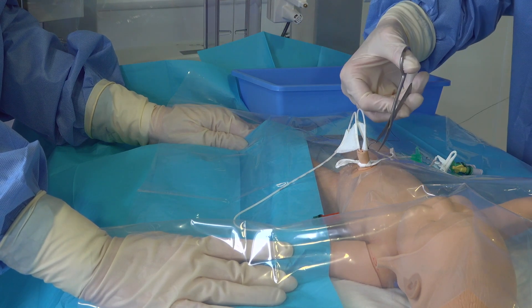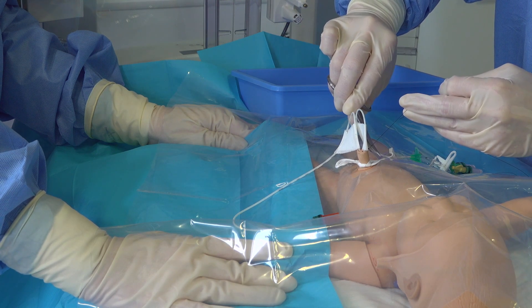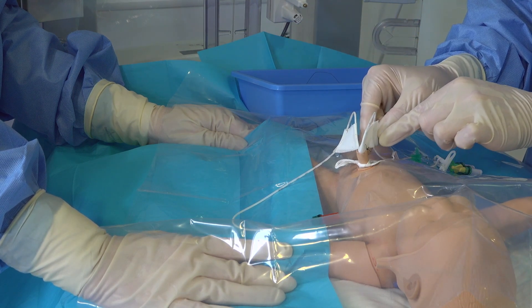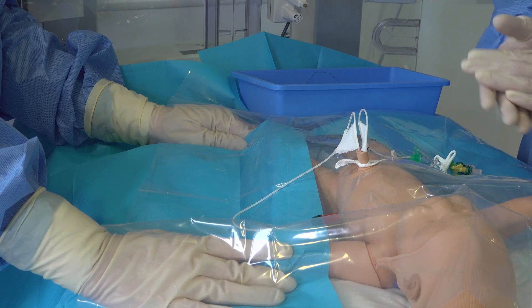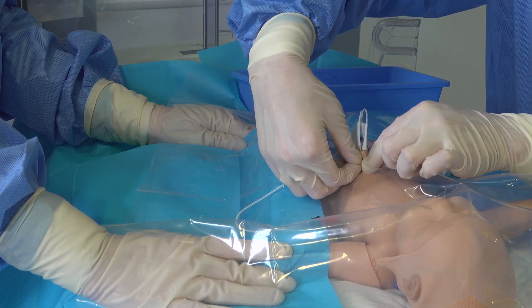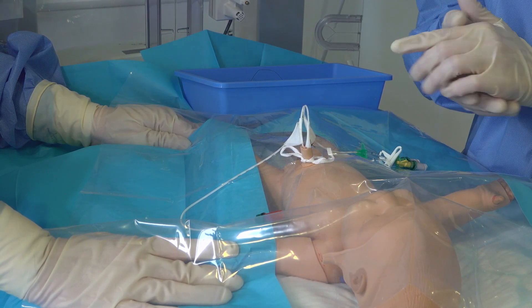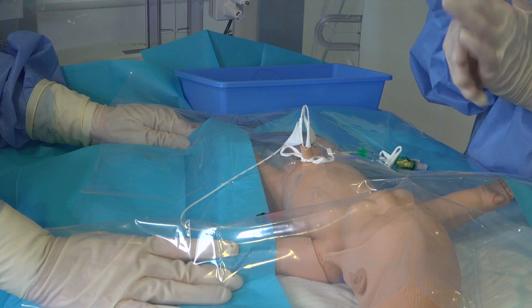Now with your scissors you can cut your suture to the base of the cord, putting everything back in your box. We then do this again at the other side of your white tape to keep it in position, and again twice on your arterial line. Once you've done these four sutures, make sure that your lines are secure. Loosen your cord tie slightly at the base. I keep it in position until I have done the X-ray to confirm my line position, but make sure that the tie is not on the baby's skin just to make sure that this does not become necrotic.